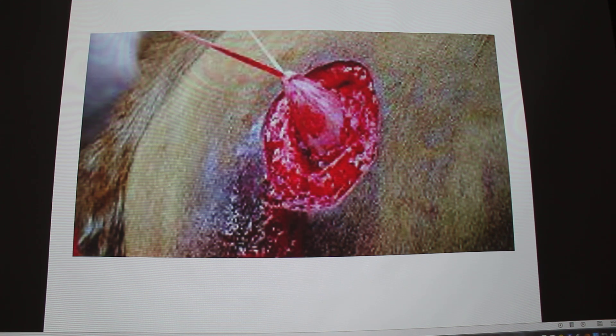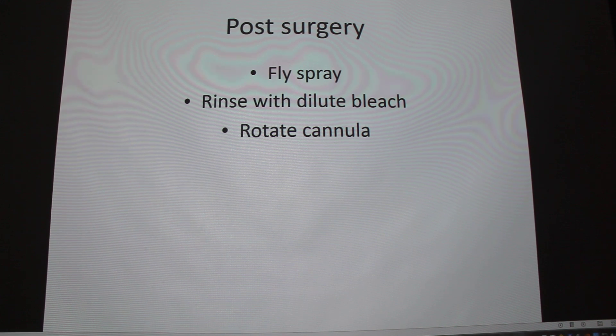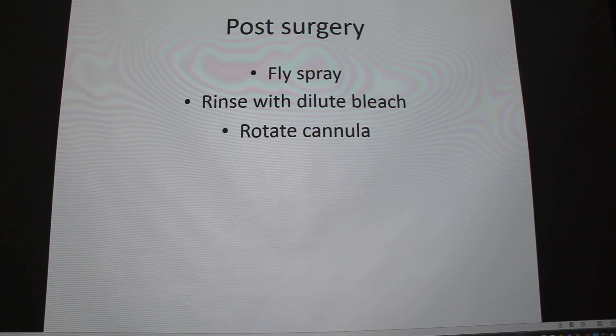You place the cannula in, keeping it in warm water so you can move it around because it's very tough. Then you do some stay sutures and you're pretty much done. Post-surgery is pretty basic — everybody applies fly spray because that smell will attract a lot of flies. You want to do some rinses because it's an open wound and they're kind of just laying in their own filth all day. You also rotate the cannula so the skin doesn't fuse to it — to prevent adhesions.